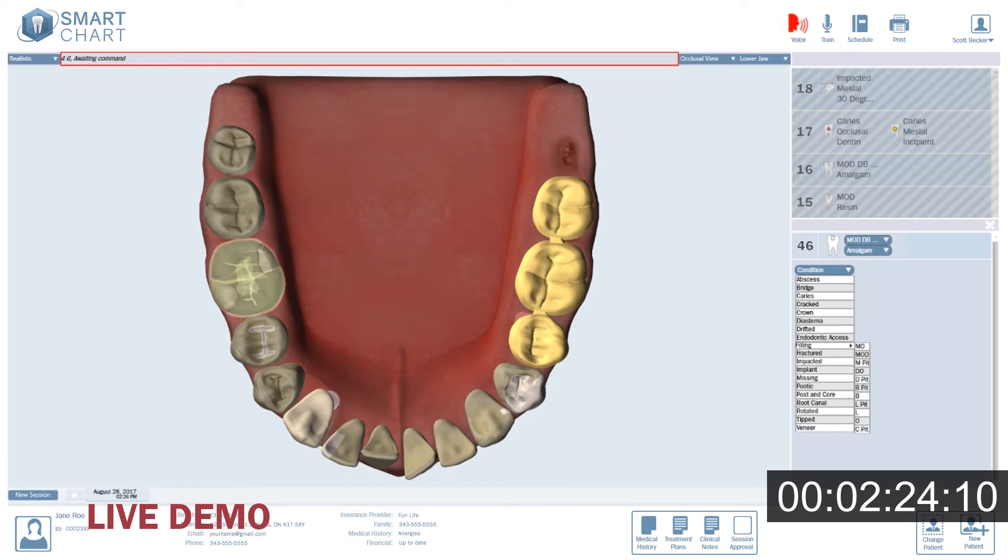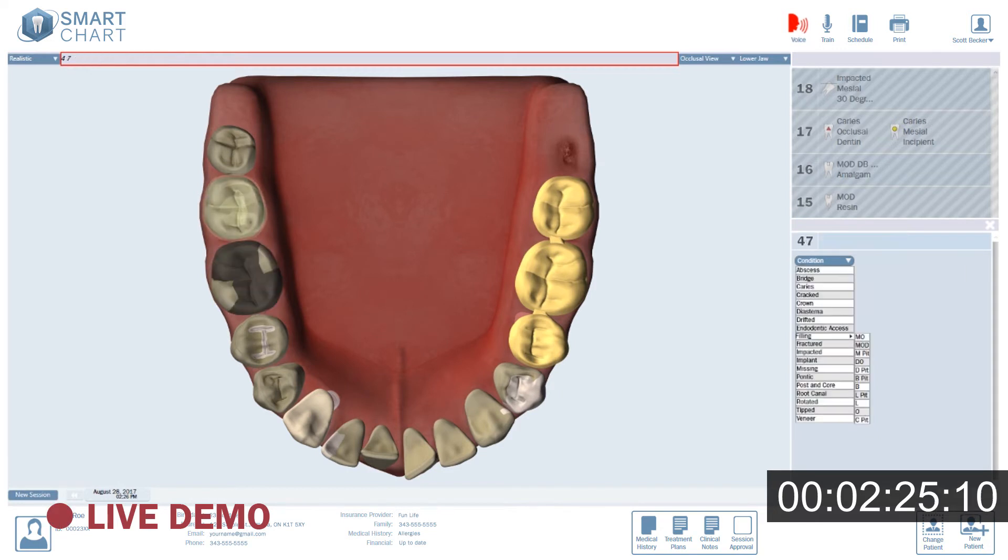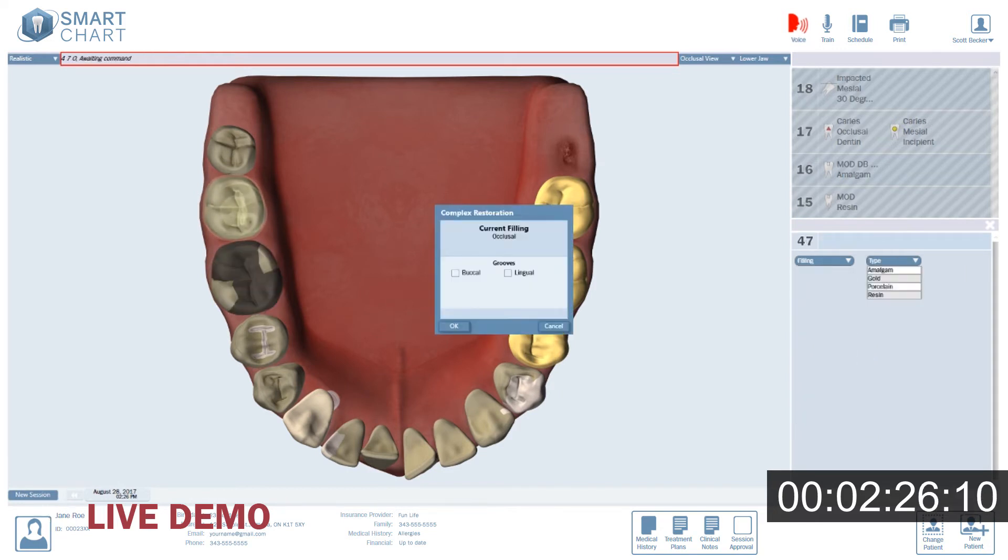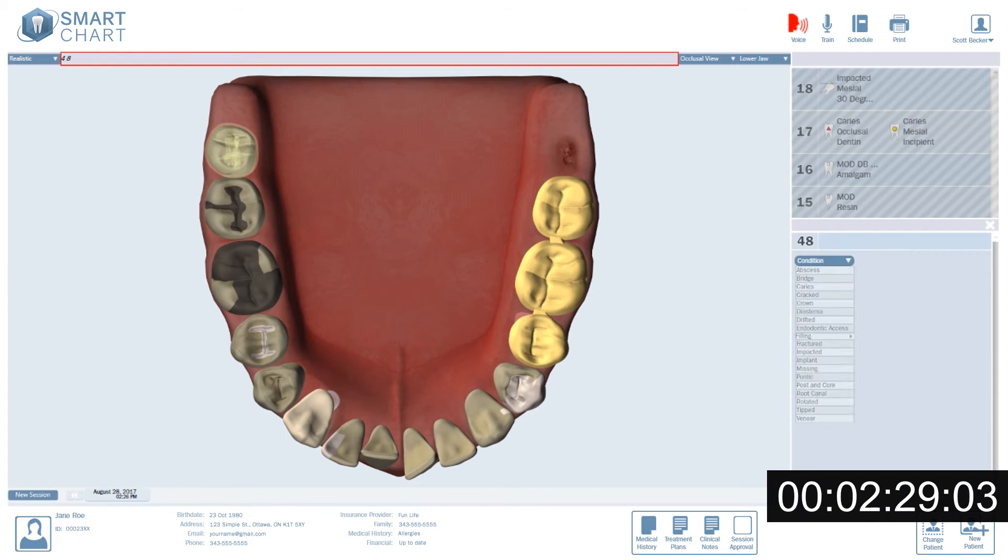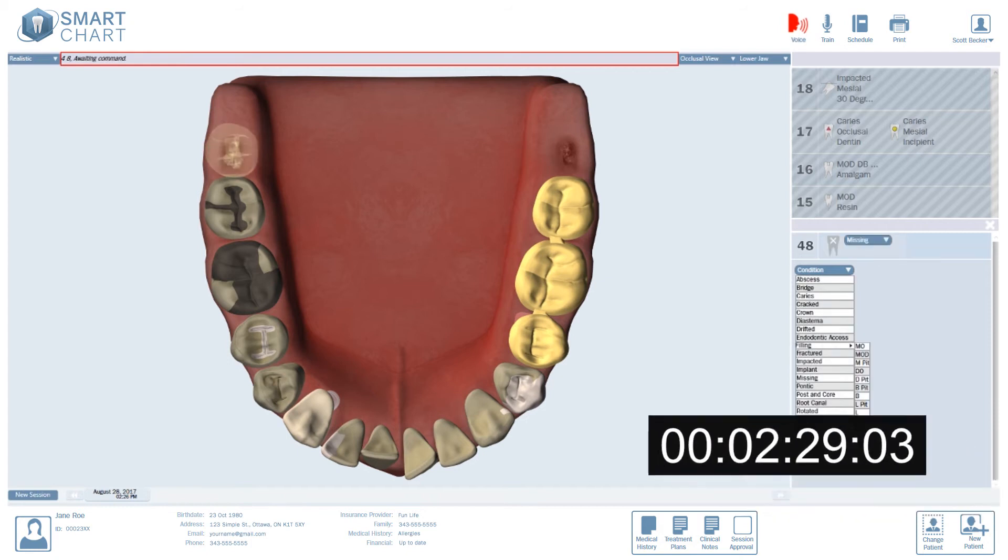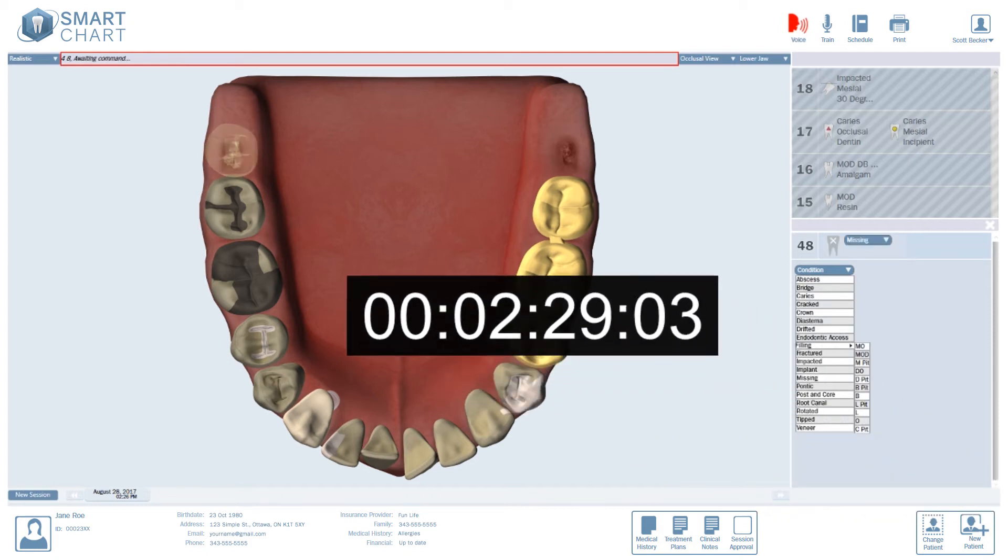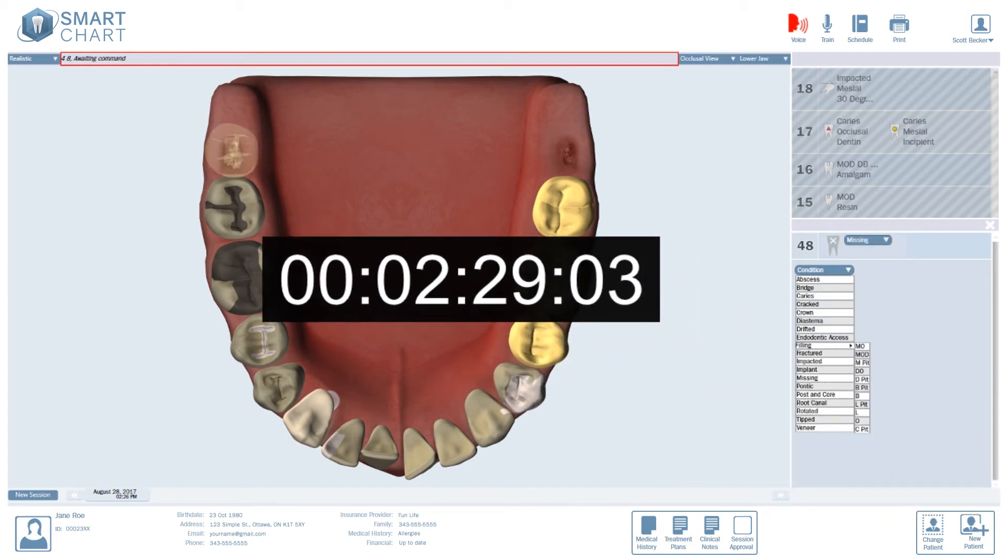4.7. Occlusal. Buckle groove. Amalgam. 4.8. Missing. So that came out to about two and a half minutes. Pretty impressive by any standard.